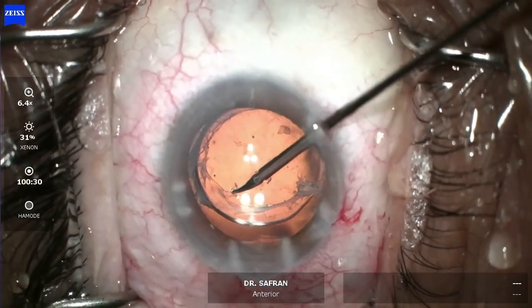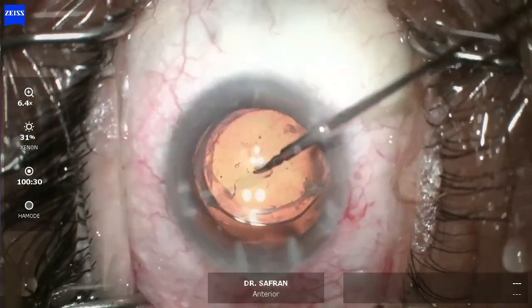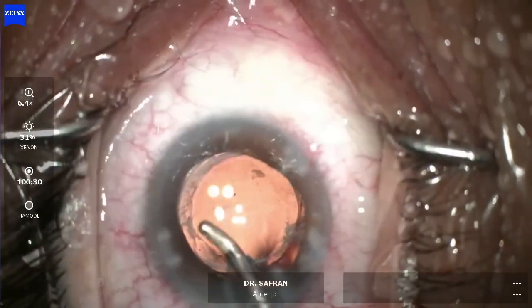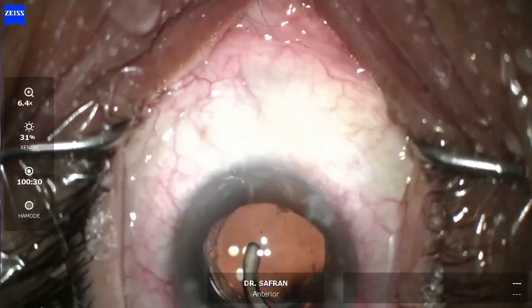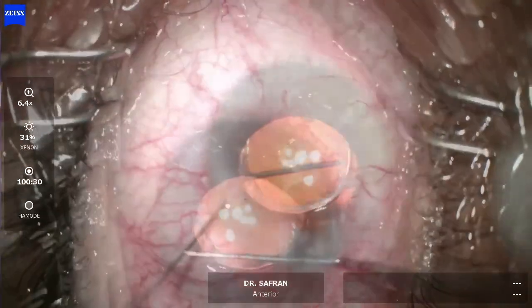Now we've got the lens in the bag. I'm going to make the capsulorhexis opening just a little bit bigger on the other side with the micro scissor. The lens centers very well. We remove the viscoelastic, and now I'm going to try to bring the pupil down using Miochol.